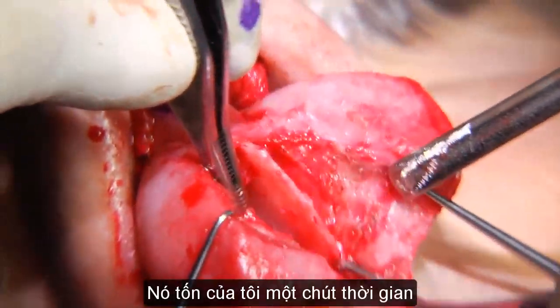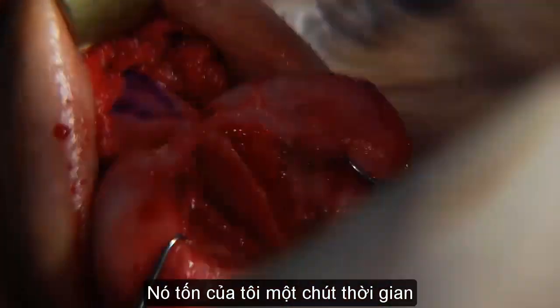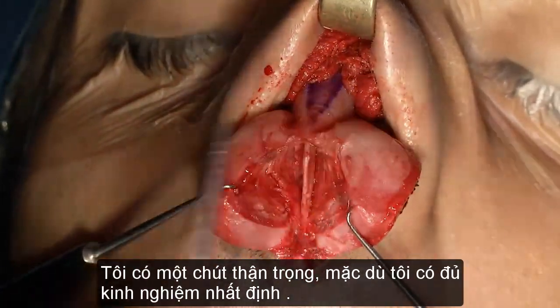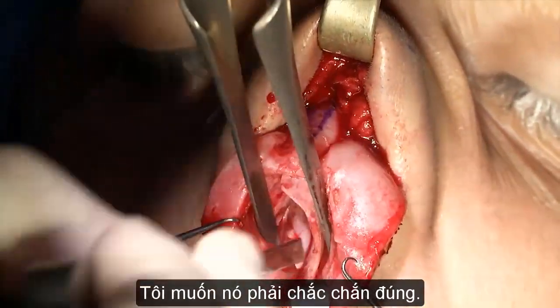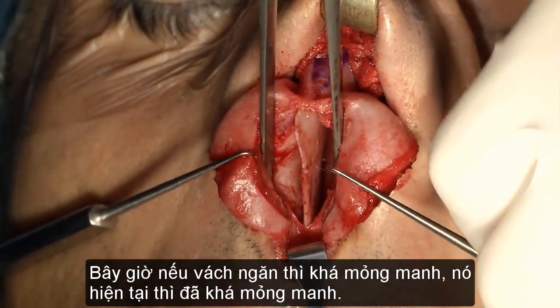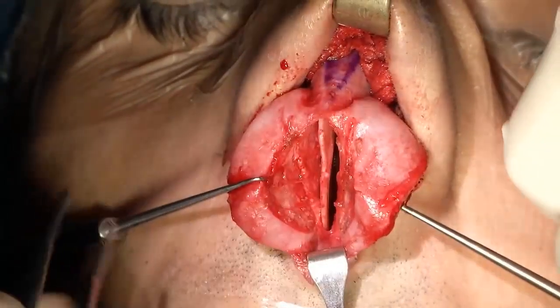And there we go. So it did take me a little time, and even if I have a doubt, though we have a certain experience here, it's still a fact that this plane needs patience. I want it exactly right. Now, is this septum flimsy? It's relatively flimsy. It's kind of flimsy.